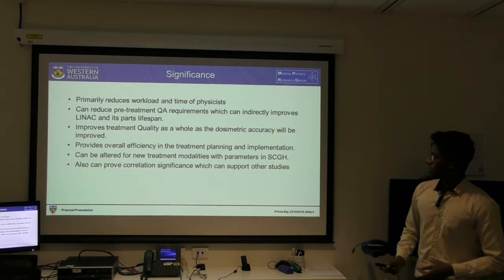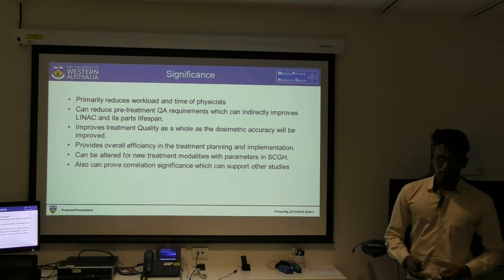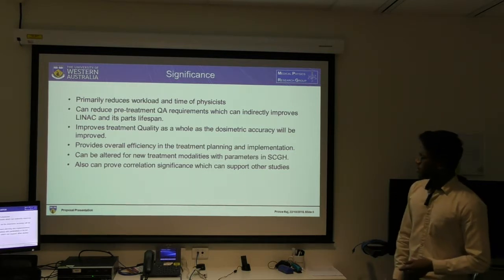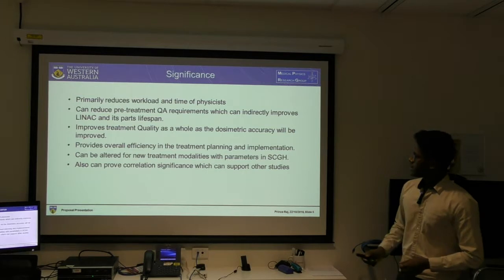It improves the overall treatment quality, and dosimetric accuracy will be improved, because if we focus on highly complex plans such as head and neck, that will optimize the treatments and increase the dosimetric accuracy of those plans, instead of wasting time on less complex plans. It provides overall efficiency in the treatment planning, which is pretty much the quality.